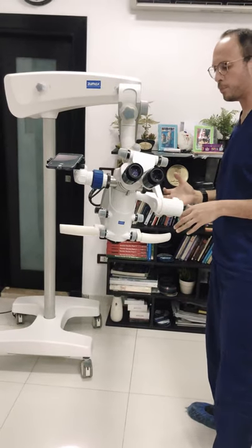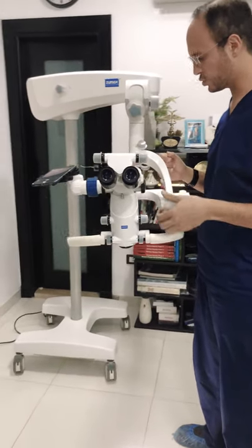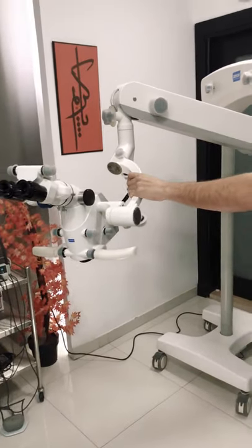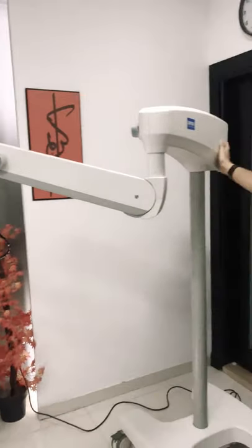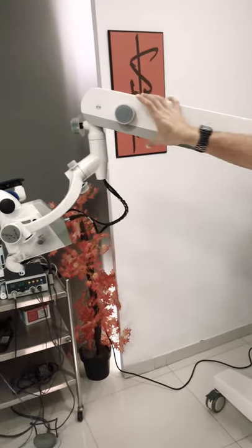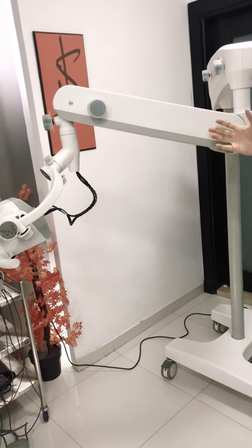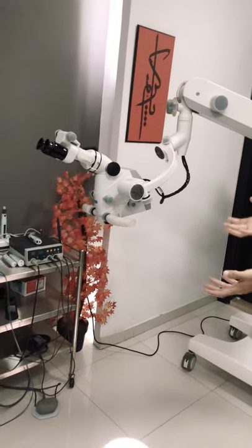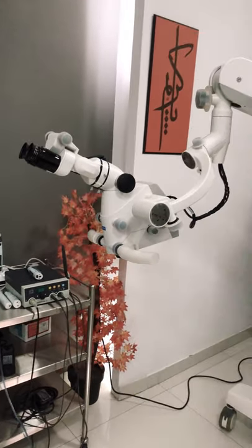There are several aspects to appraise in this microscope. First, reviewing the design itself, you notice a bit of bulkiness. The LED portion is built into the arm, and the supporting arm to the head itself is a bit thicker and larger in size. The difference is attributable to the heaviness of the microscopic head, with integration of several aspects inside it that we will come to.